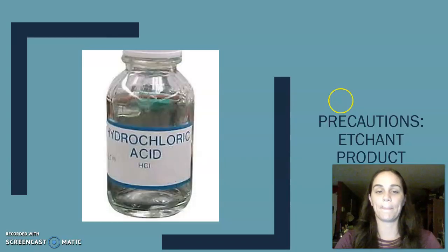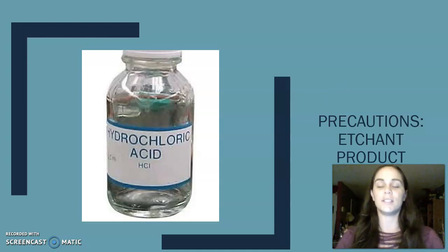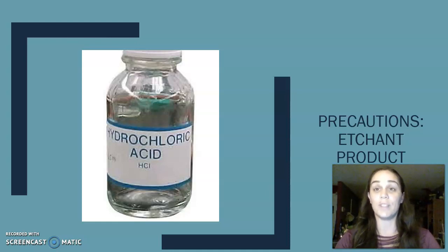The precautions when doing this procedure: the etch product does have hydrochloric acid in it, and it can burn your eyes, skin, and mucosal skin inside of the mouth. That's why we use the dental dam to try to prevent that, and gloves and eyewear.